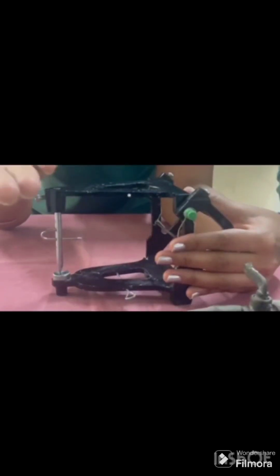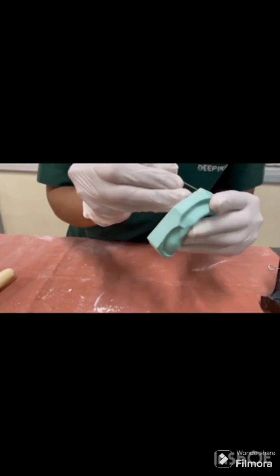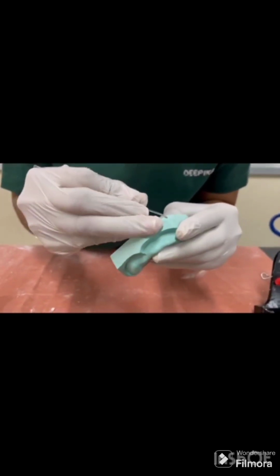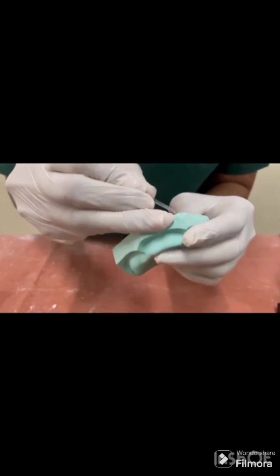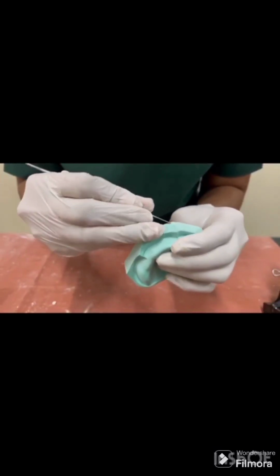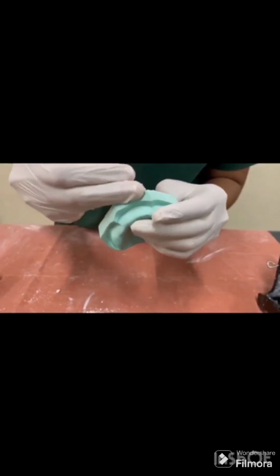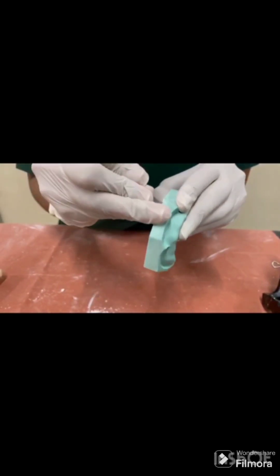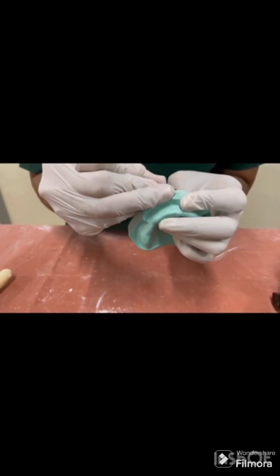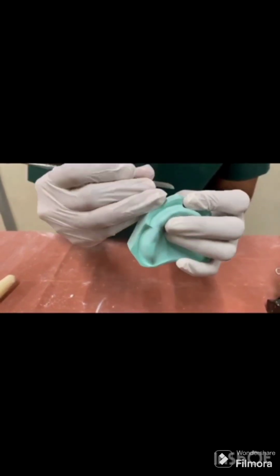What are the additional requirements? It should accept a face bow transfer record, adjustable condylar guide elements, a terminal hinge position locking device, and mounting plates. Next is notch indexing. It is a simple method wherein 3 V or C-shaped notches are marked on the 3 corners of the cast, one anterior and 2 posterior. The notches are created using a sharp knife or lathe mounted wheel. The disadvantage is that if the cast is trimmed to reduce the size, the indexing is lost.